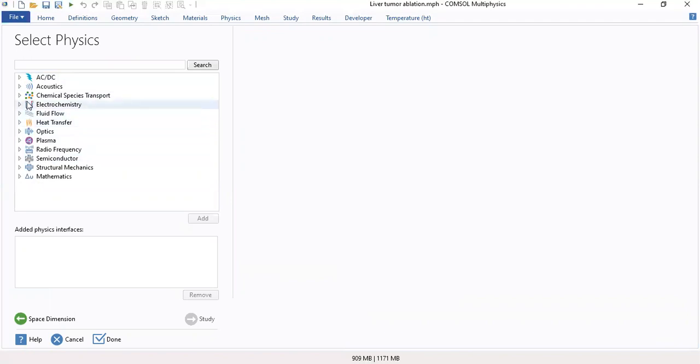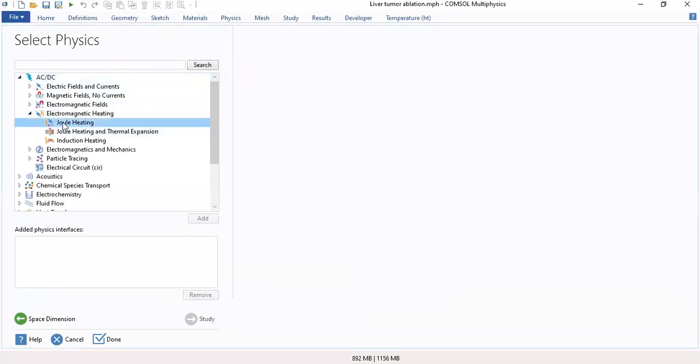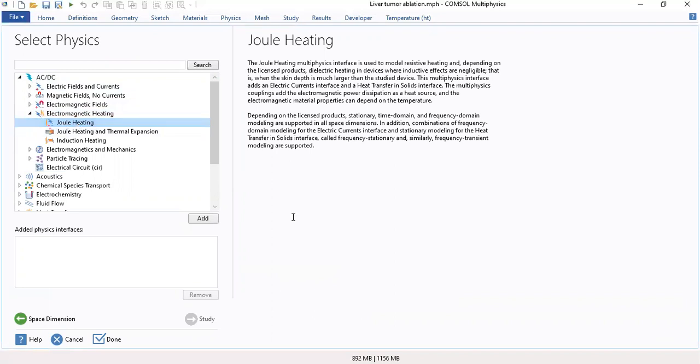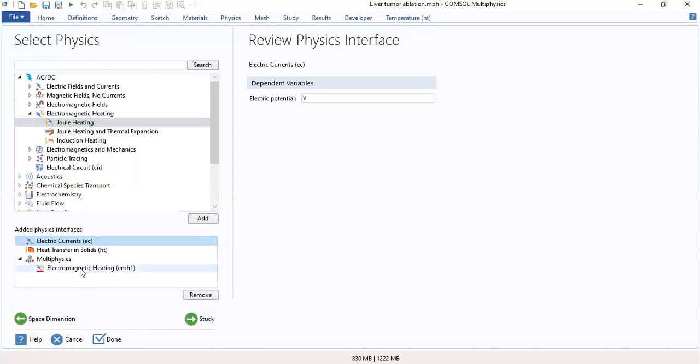And you are going to go to, where is AC/DC? And electromagnetic heating and Joule Heating Module. So this is where this converts electrical current in your model to heat, and this heat will be applied to the surrounding tissues. So you add it to your model. And it shows you the electrical current module, the heat transfer in solids module, and the multi-physics electromagnetic heating module.